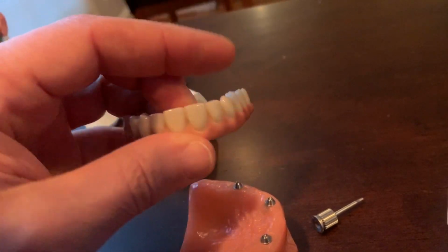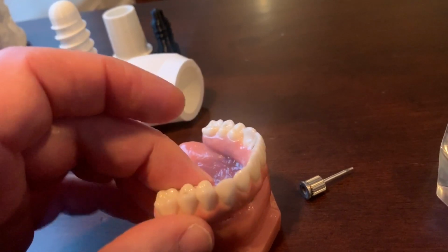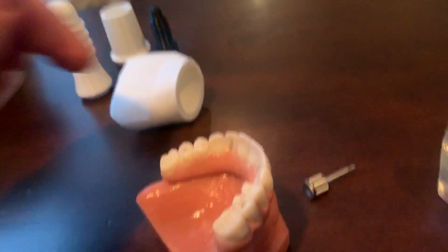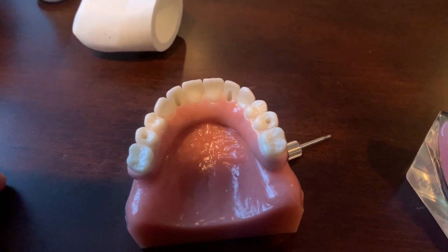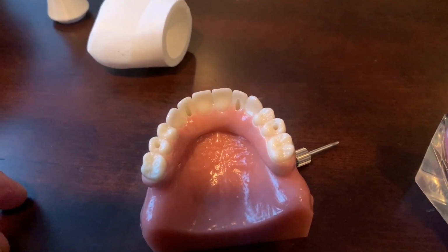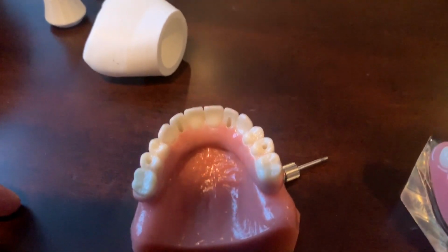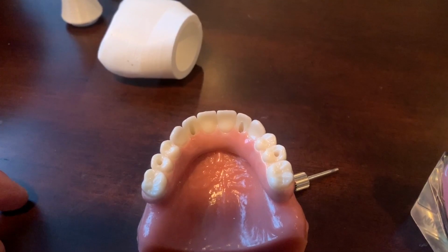This is the underside of the bridge, and it gets placed on top of these implants that have been placed, and then inside these little accesses, there are little tiny screws that permanently place this bridge. These bridges are made out of a porcelain or a specialized material called zirconia. They're very smooth and highly polished.